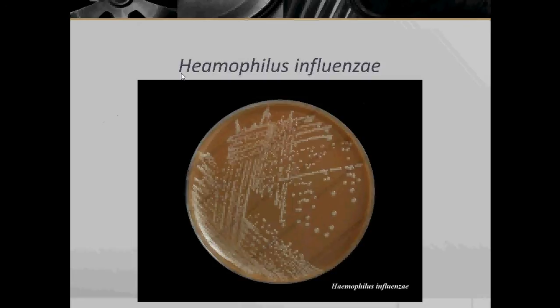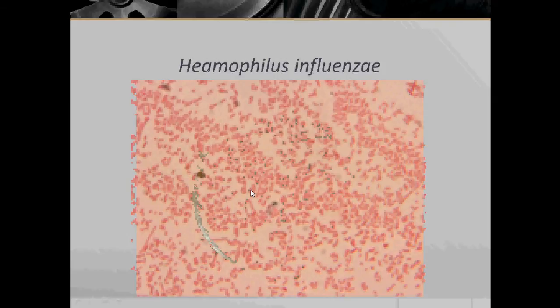Here we can see Haemophilus influenzae growing on chocolate agar. Under microscopic view, they exhibit a school of fish arrangement.